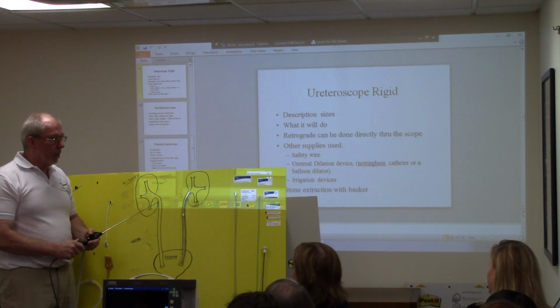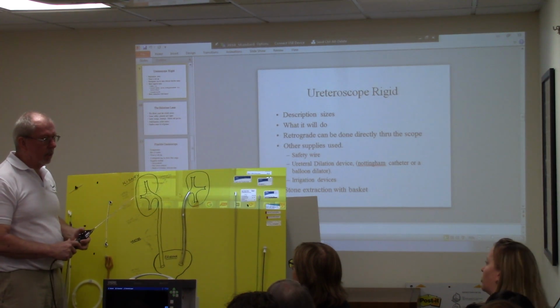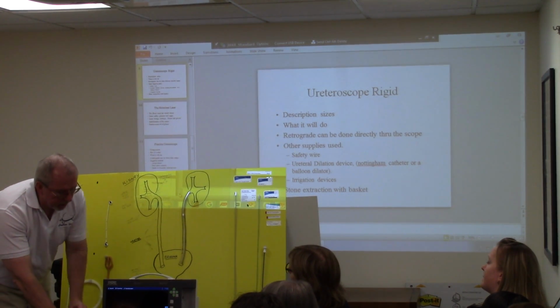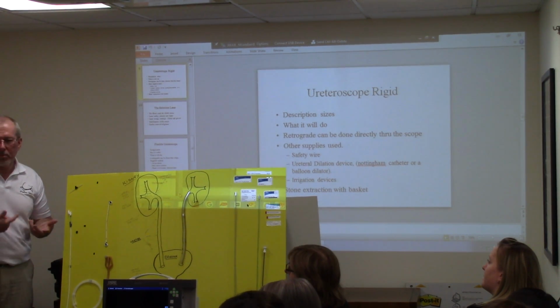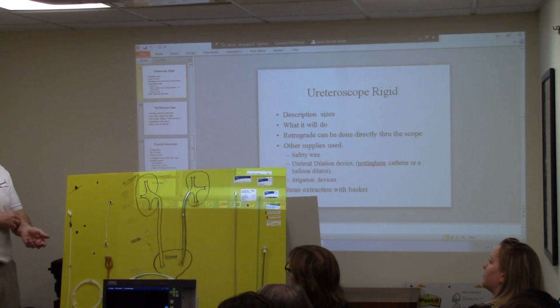How do they choose that? Is it on the preference of the doctor? Do they charge different types of dye? We have different codes. One is a very basic, cheap dye. Well, it's not that cheap, but it tends to cause more allergic reactions. And then we have some that are a lot more expensive, and when you inject those, they don't cause an allergic reaction. Or if you have a sensitivity to dye, that's what we use.